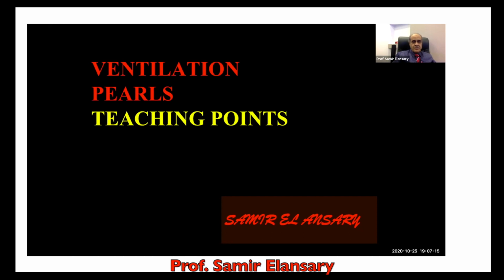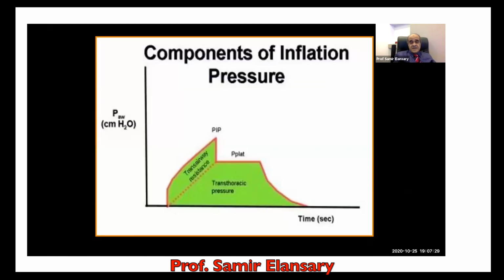Good evening, our attendees. Today I am going to speak about ventilation teaching, some teaching points I select for RDS and for management of any patient on ventilator in general. At the start, I want to stress on some points which are very important, and every intensivist must be oriented by them. What is the difference between the peak inspiratory pressure and the plateau pressure?